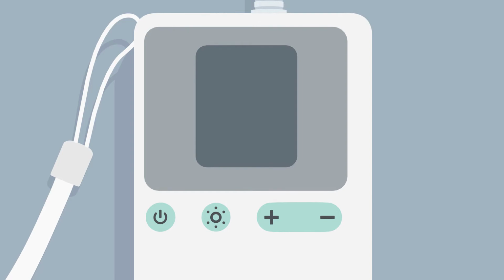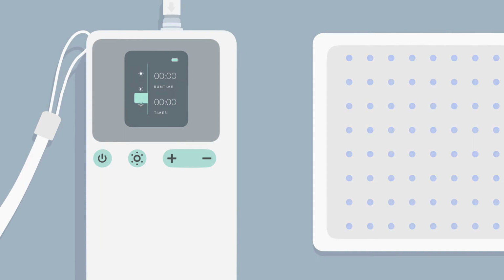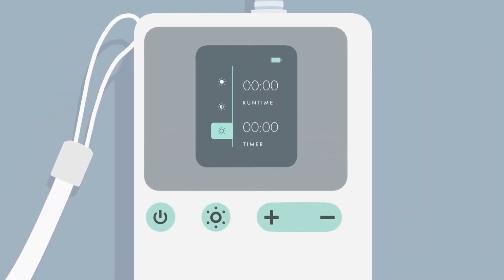injury. The buttons on the control box include the power button, to power the phototherapy device on and off, the light intensity control button, which allows you to set the light intensity to high, low, or off, the 30-minute increase button. Use this to increase the scheduled operating time by 30 minutes in timer mode. The 30-minute decrease button. Use this button to decrease the scheduled operating time by 30 minutes in timer mode.